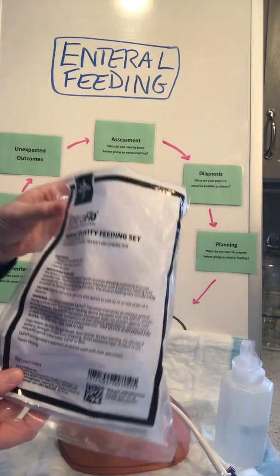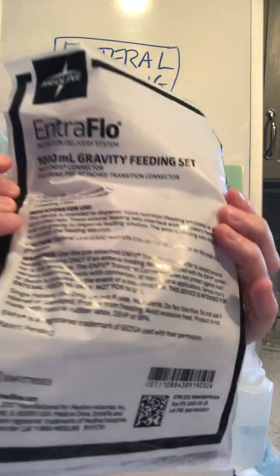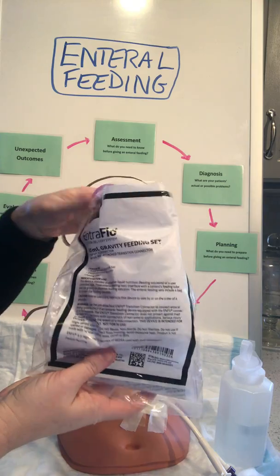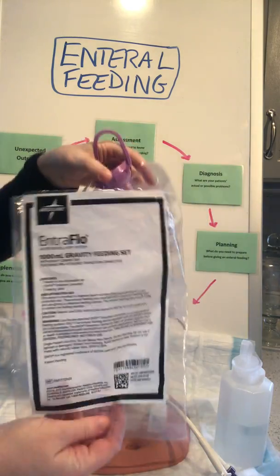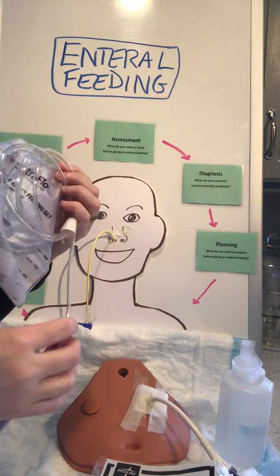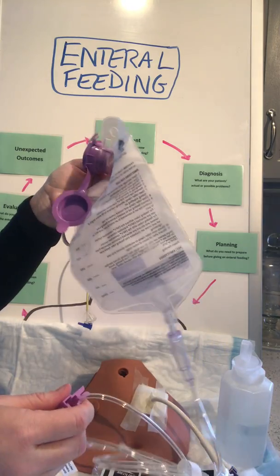Okay, so now we're going to talk about the tube feeding bag, the enteral feeding bag. I'll let you see. This particular brand says the Gravity feeding set. They all basically look the same. Now in the hospitals, you're more likely to see the exact same bag and tubing attachment, but it's got a portion of the tubing that's set to go in a feeding pump. And the pump is what's going to control the rate or how fast this goes into the patient's stomach.